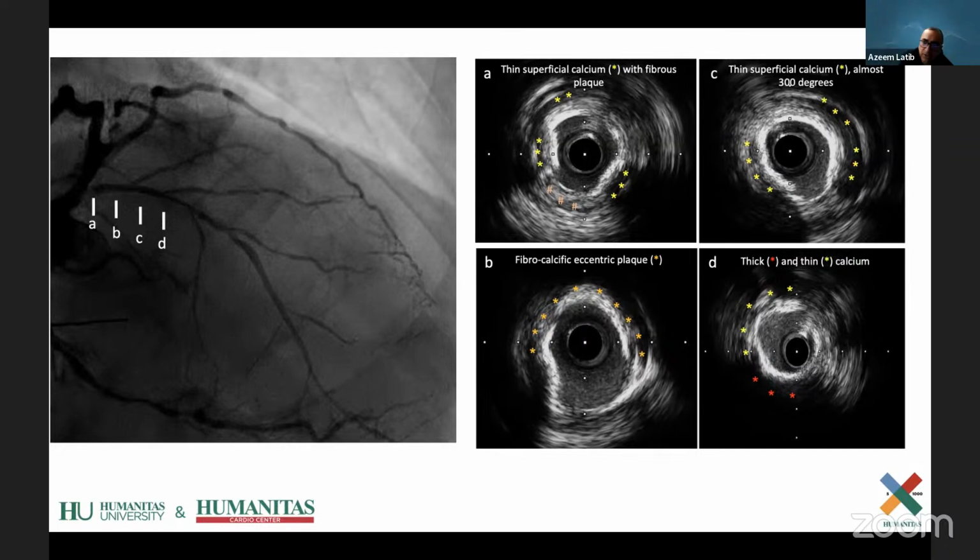Can I just ask a question, Antonio? Yeah. Maybe again, just for the fellows, right? The EF was normal in this patient. Yeah, but the only thing, even if you look at the last paper that has been published in JACC Interventions, comparing rotablator with orbital atherectomy, there are still 12%, 15% of patients who can have no-reflow plus impairment of the distal flow.